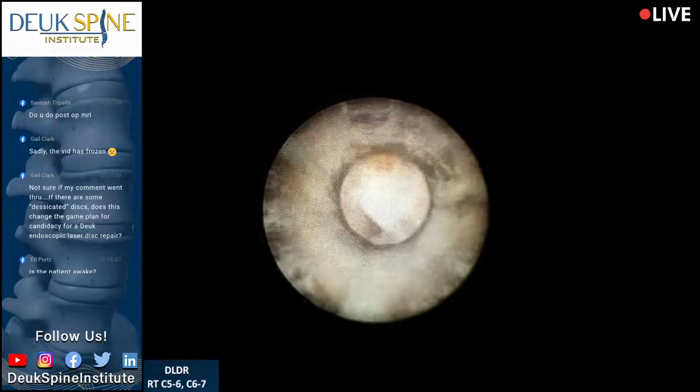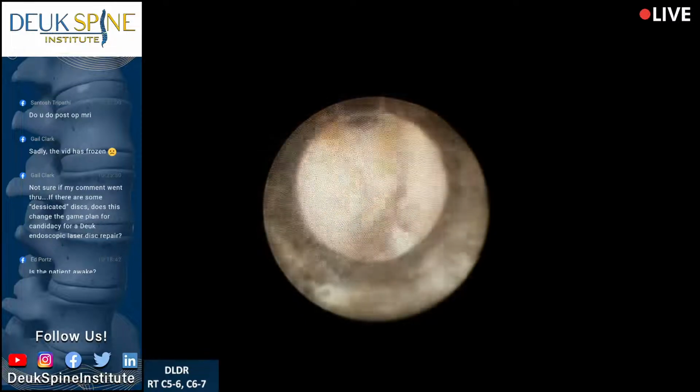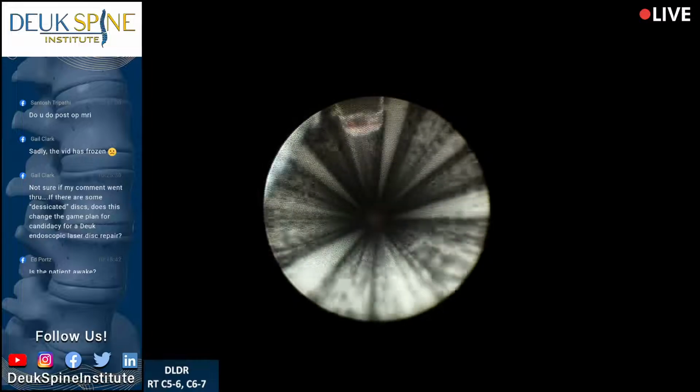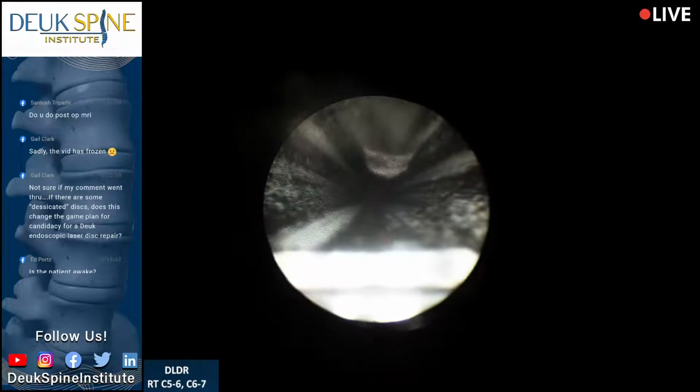There's another herniation right there. You see it? It's kind of like fishing. Trying to get these fish out from the underworld. Fishing from the underworld.